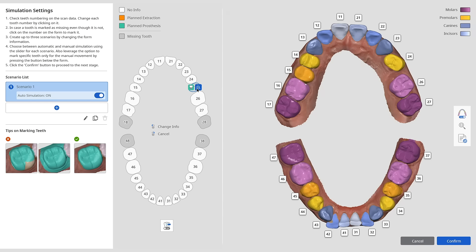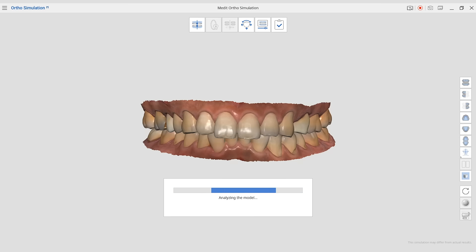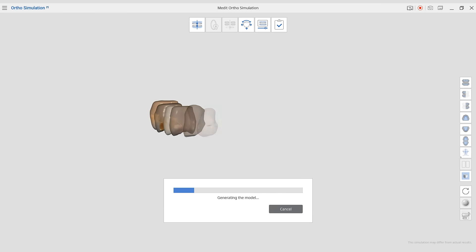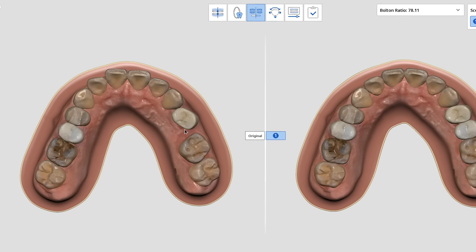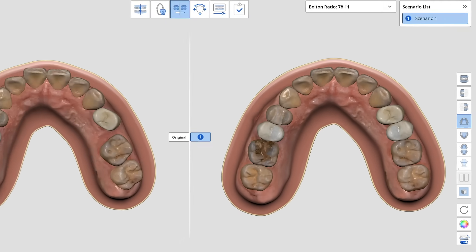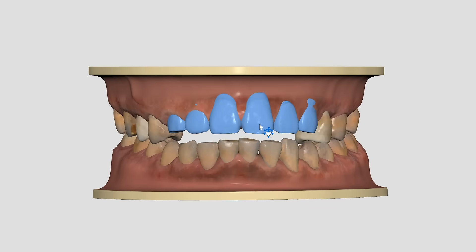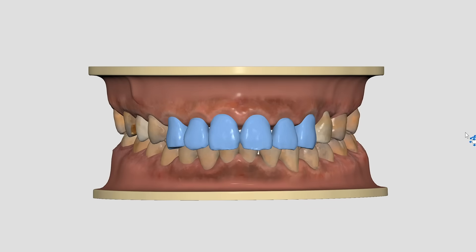You can now set missing teeth as the ones that will have implants and proceed with the simulation. The program will automatically create a tooth in that empty space, so it's easier for you and your patient to imagine how the treatment will go. Another thing we worked on is to make the adjustment process easier and much more flexible. Now you can move teeth not just one by one, but several at the same time. You can also watch the movement simulation for the chosen teeth only.